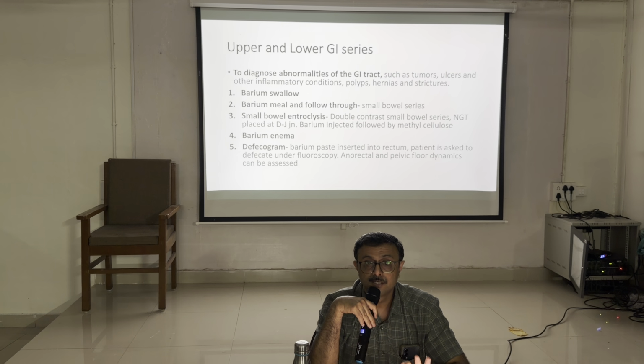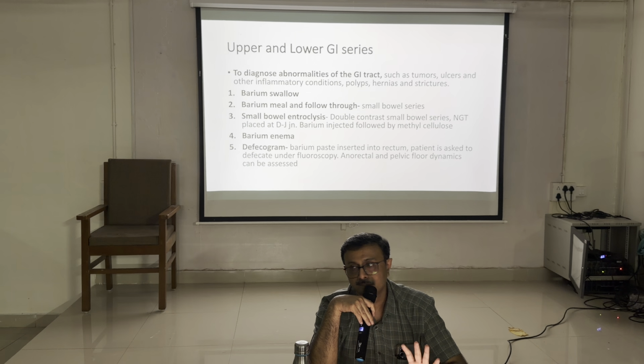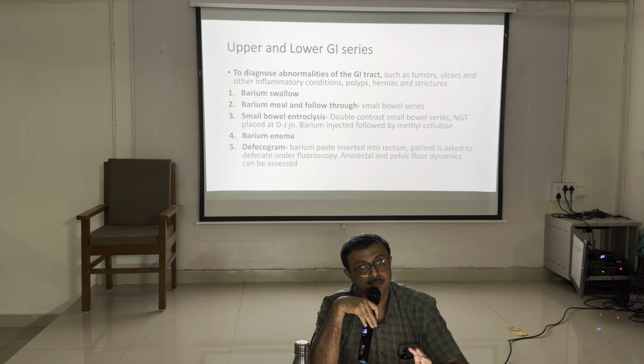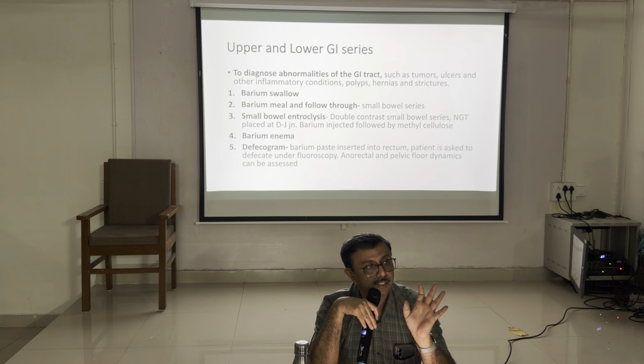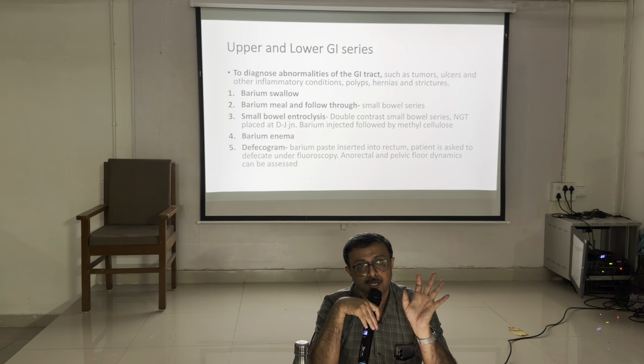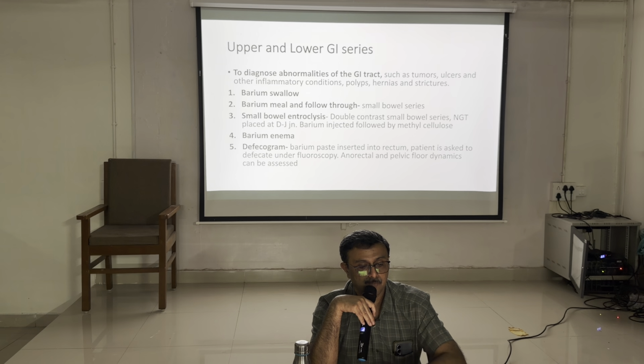Barium swallow is again not for organic causes but for functional causes. Functional conditions of the esophagus can be assessed only by barium, not CT scan and not endoscopy, only barium. So still it has value.